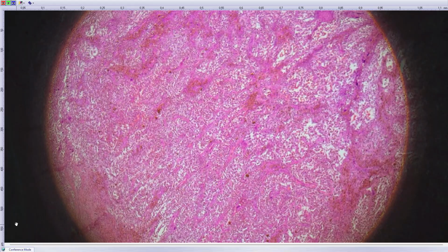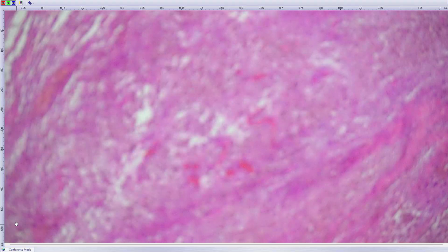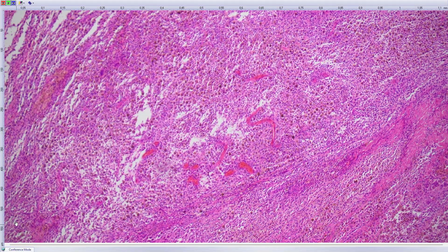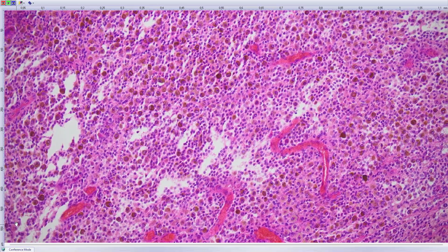Yeah, my last case, it's very easy. Easy one, probably. It was a tumor of the knee joint, involving synovium and destroying the knee joint. Diffuse.